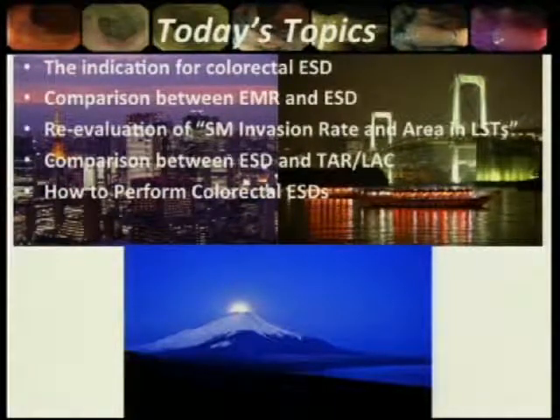Today's topic includes the endoscopic diagnosis and indication for colorectal ESD and comparison between conventional EMR and ESD. And finally, I talk about how to perform colorectal ESD safely and effectively.